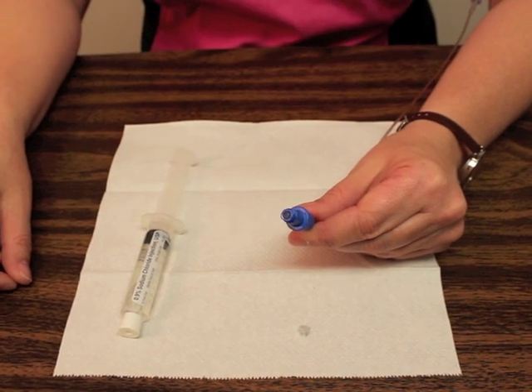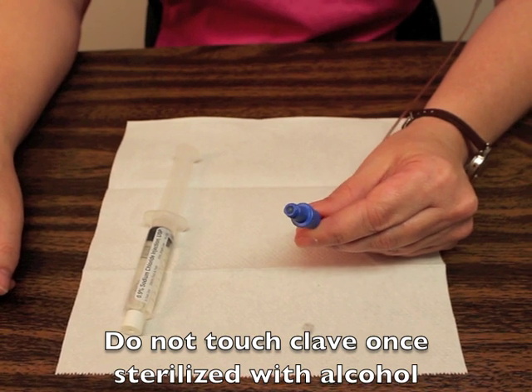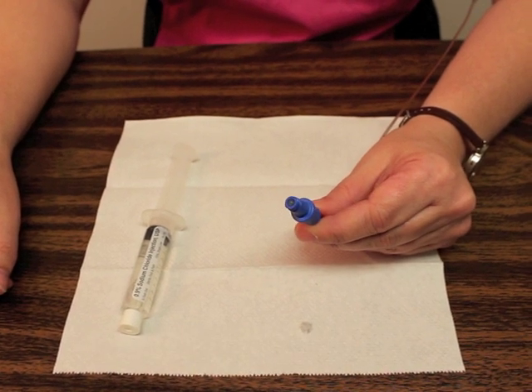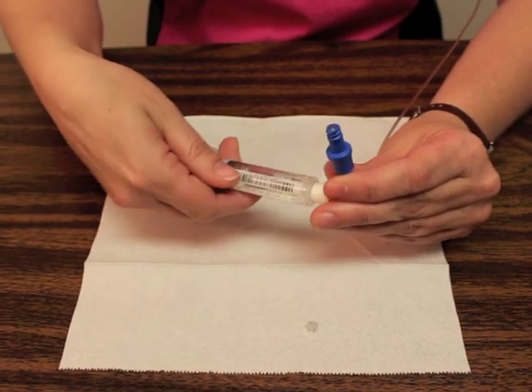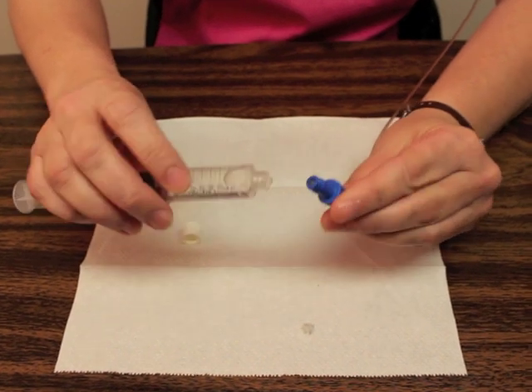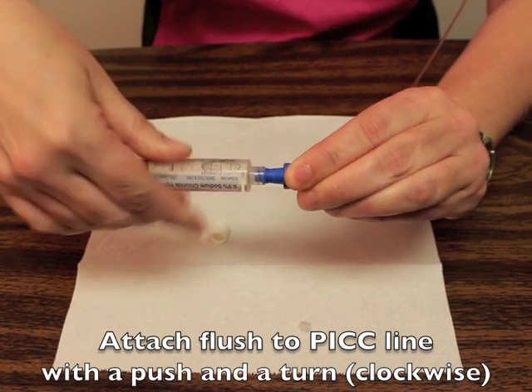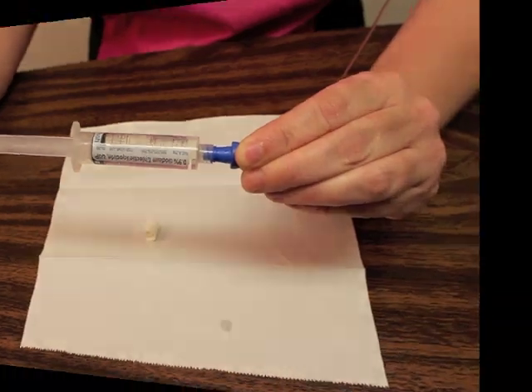Now that your clave is clean, you're not going to want to touch any part of it. If you do, you're going to re-clean it with alcohol. To attach your saline, these two ends are a luer lock — it's a push and a turn. Now that your saline is attached, you're ready to flush.